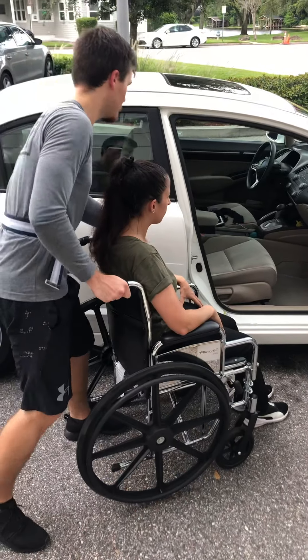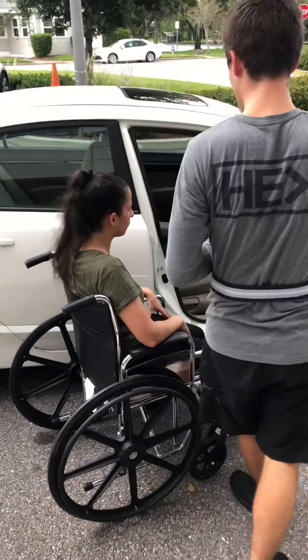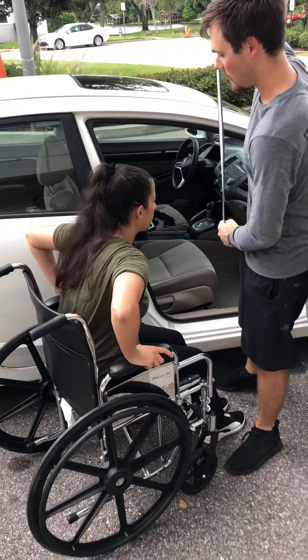I'm going to put the brakes on first. With both those hands, I'd like you to put them on the armrest. Lean forward for me so I can put the gait belt on you.